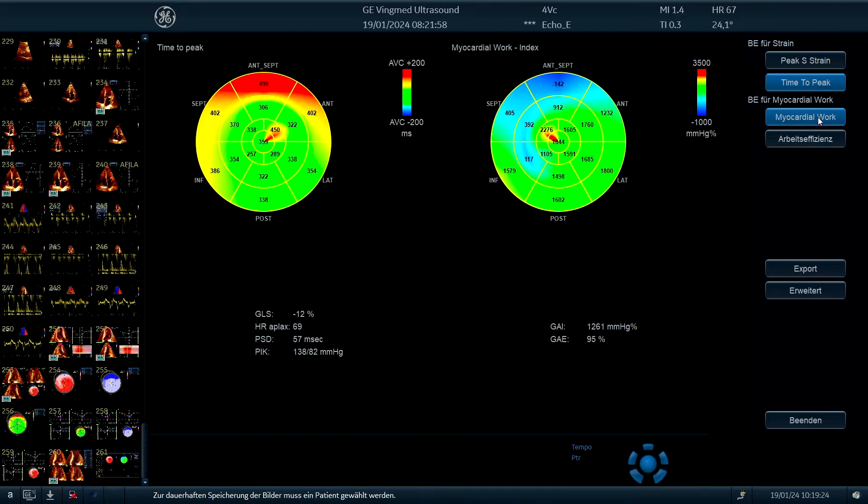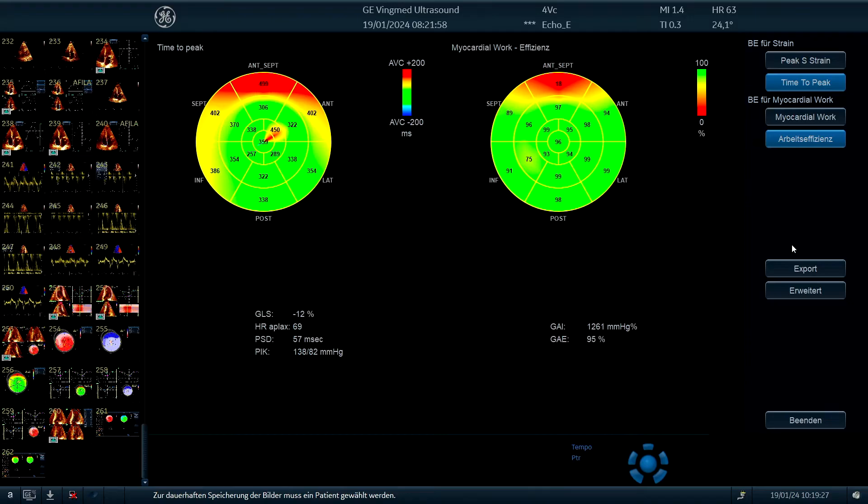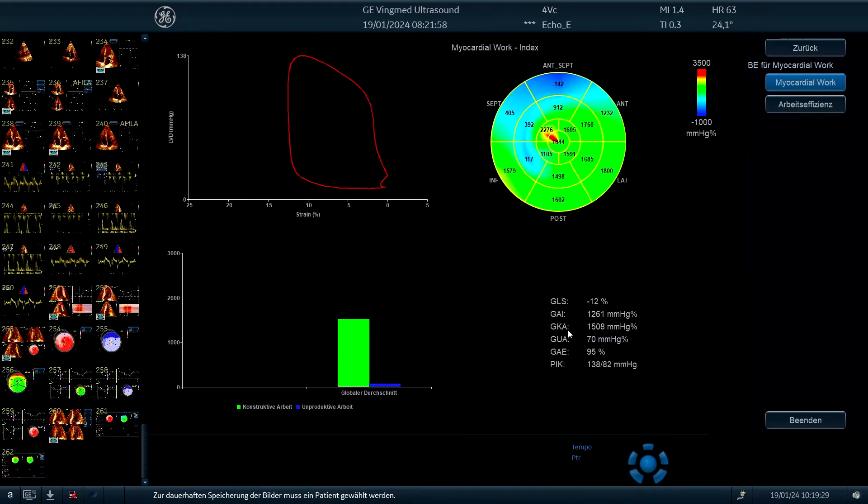and also how the heart is actually working. And we see several measurements, so here we have a global work index, it's reduced, not severely reduced, but reduced.